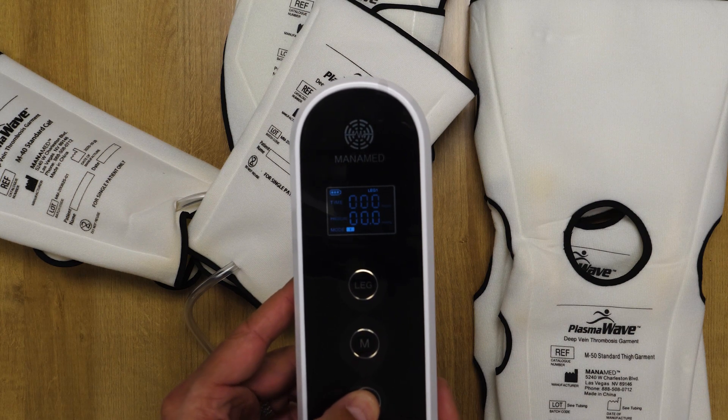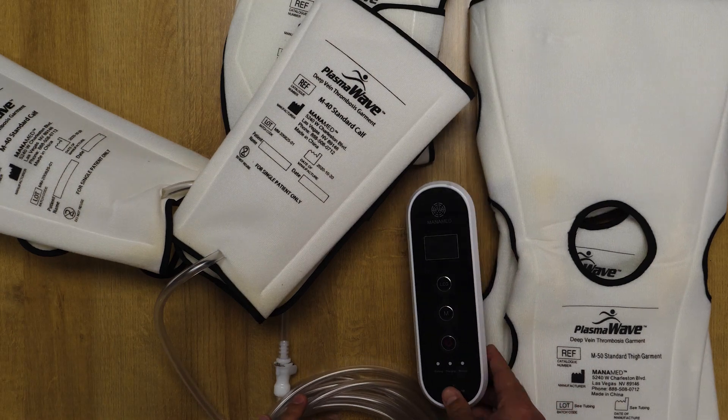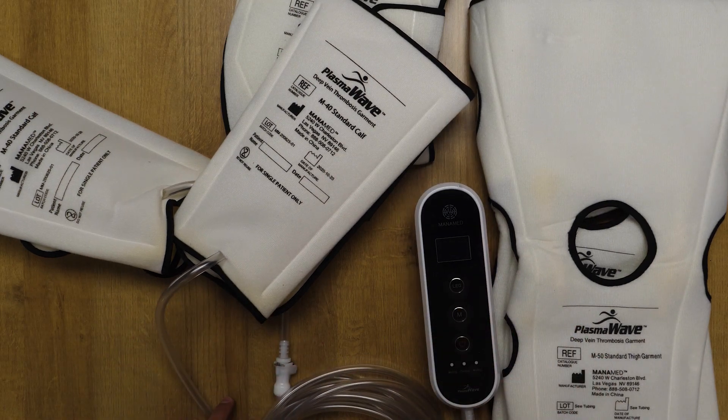We'll go ahead and power it off. And that is the ManaMed hospital-grade SCD system. Thank you.